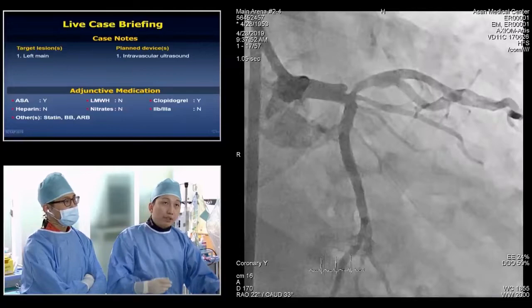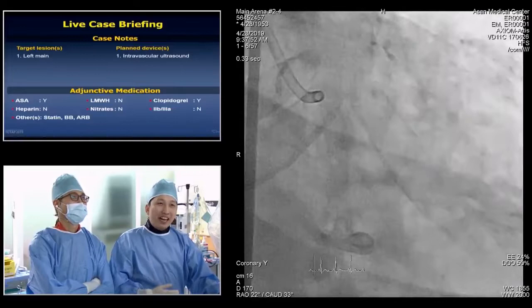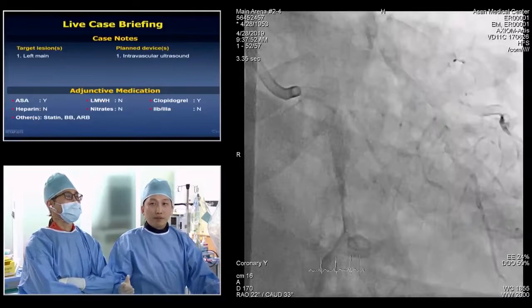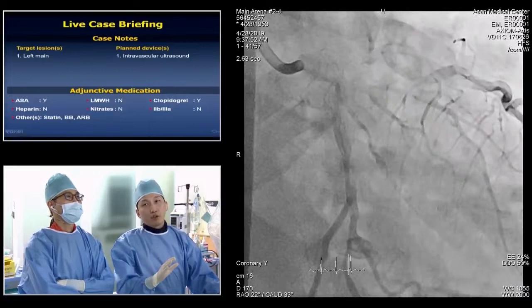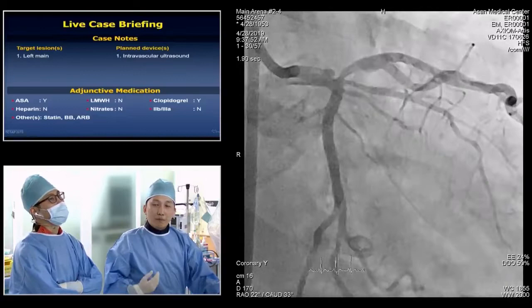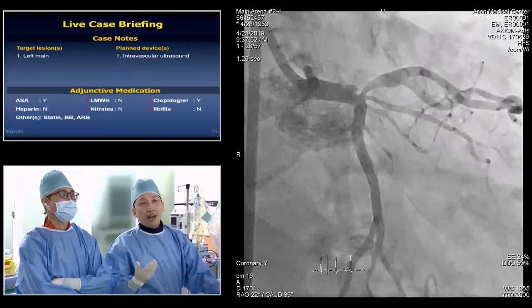Can I ask the cardiologist? Oh, yes. What risk would you quote this patient for PCI? Yes, that's what I wanted to ask the panel. I have some patients with this angiographic morphology, and this patient has a significantly low FFR, 0.75. The patient has stable symptoms, but the FFR is significantly lower, so I decided to treat the patient. But some patients with this anatomy have a normal FFR, like 0.82, 0.83. In that case, whether to treat or not is really a consideration for me, as a young doctor. So I wanted to ask the panelists, how would you treat this patient if FFR is negative, or although FFR is positive in this patient?